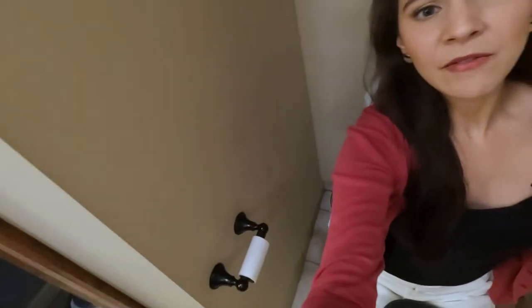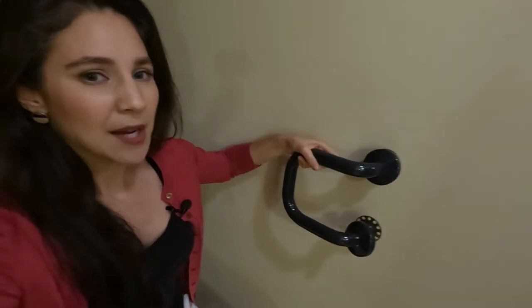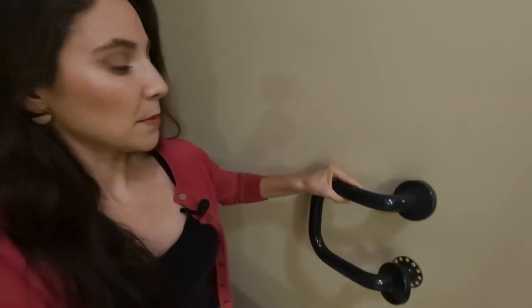All right, everybody, we are at stop number two — we are in one of my bathrooms at the toilet. I don't have any grab bars next to the toilet, so this would be another perfect spot. I love the contrast between the navy blue on this grab bar and the beige color on the wall. For helping me stand up from the toilet and slowly sit down, it would be great to put this next to the wall beside me.